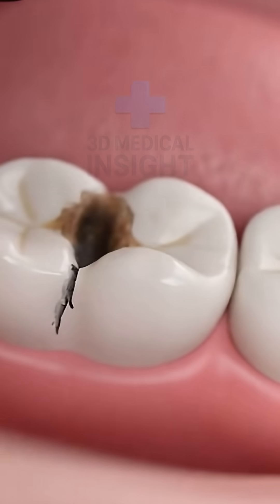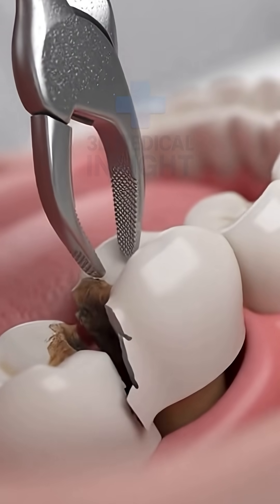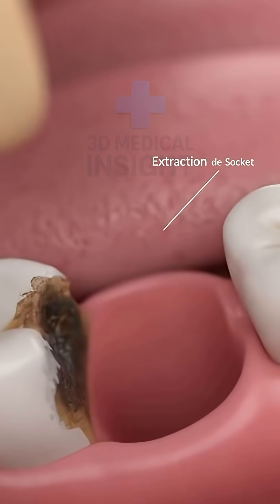A damaged tooth is identified and carefully prepared for treatment. The dentist gently removes it, leaving a clean space for the implant.